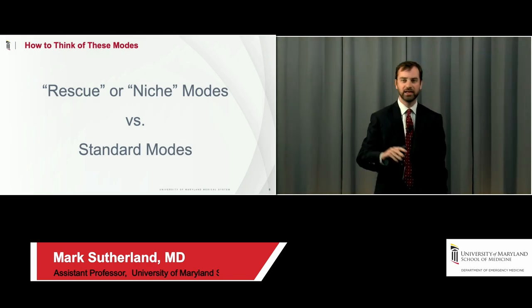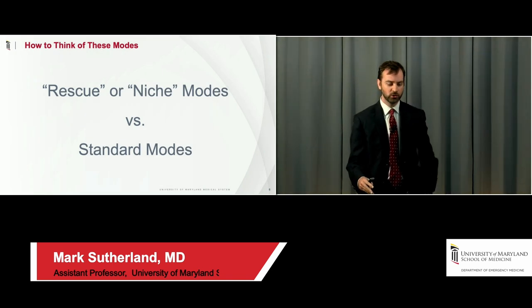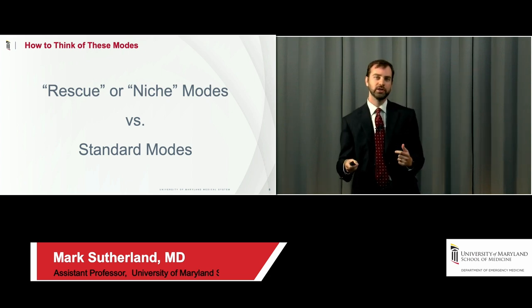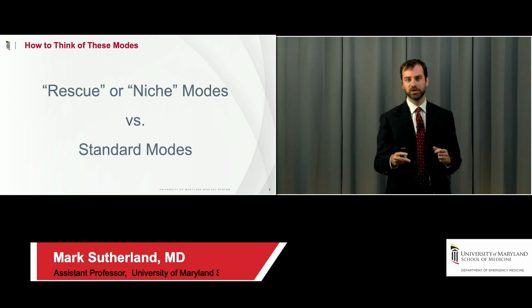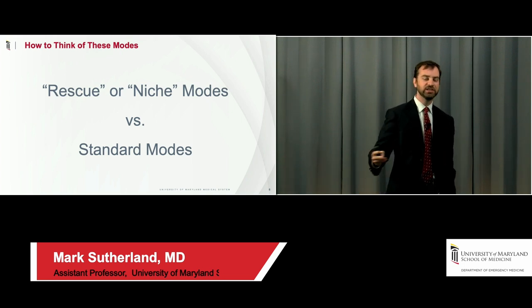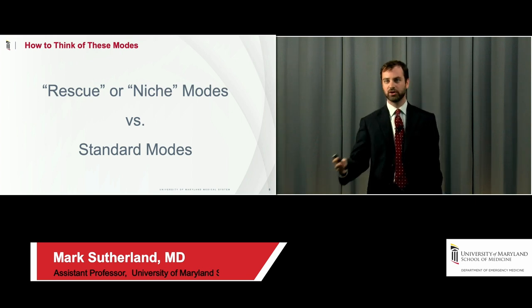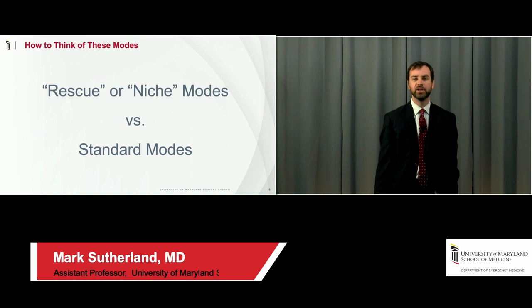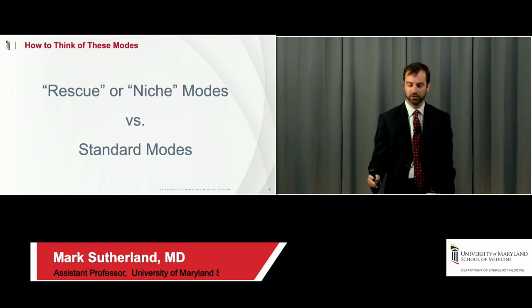And so before I get into the specific modes, I want you to all kind of mentally prep yourself. How are you going to think about the things I'm about to tell you? And I think there are two basic philosophies. One is kind of these are rescue or niche modes. These are modes that someone might give me in sign-out and they're already on it, or my respiratory therapist might place them on it. Or maybe there are certain scenarios where I use them. But they're not really my go-to. They're not really my standard of care.